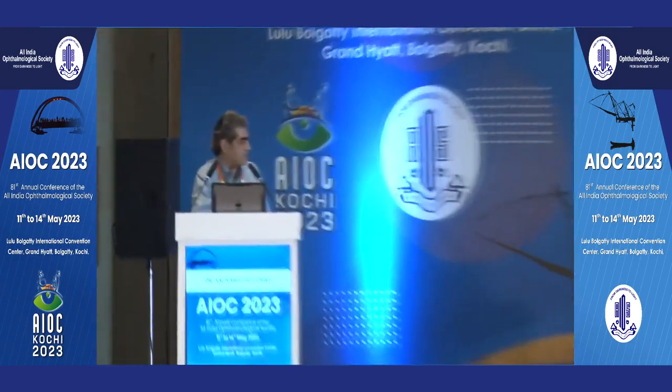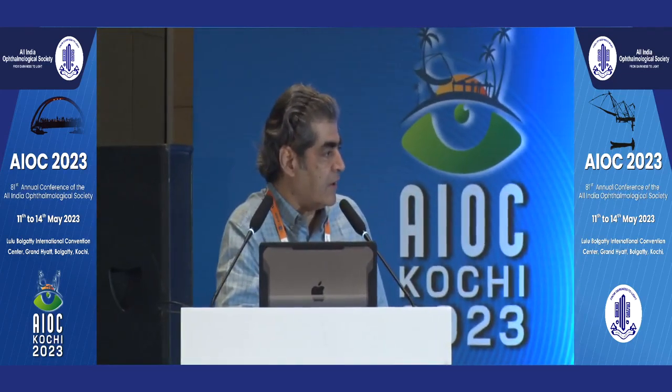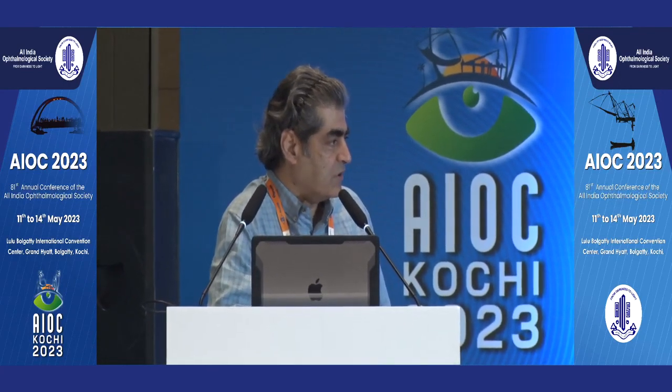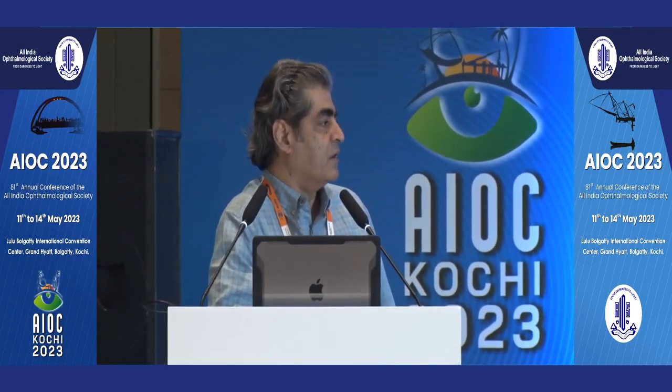The current trend is that even if you are planning an LRI or whatever besides the toric, you put it on the toric calculator and you'll have the exact amount. If the results are coming as a T2, you can actually use it, and it does pretty well like that.